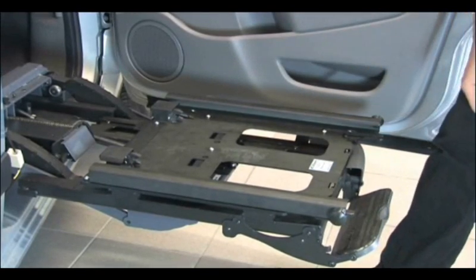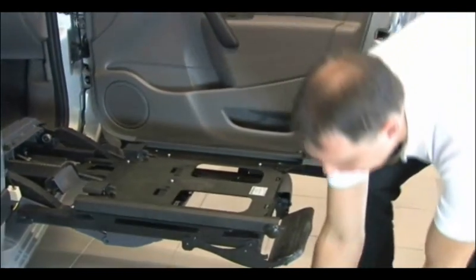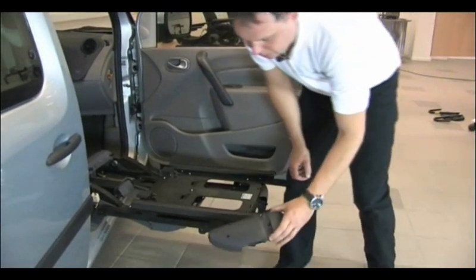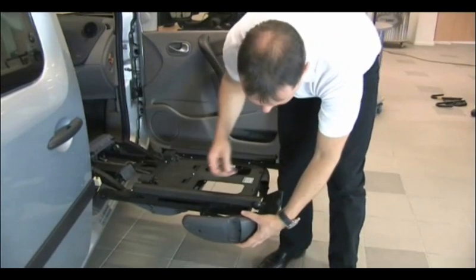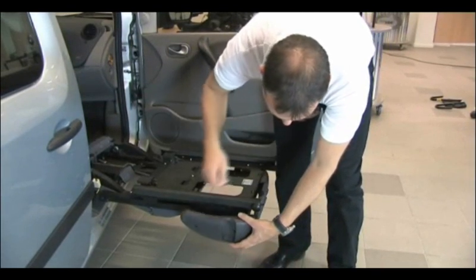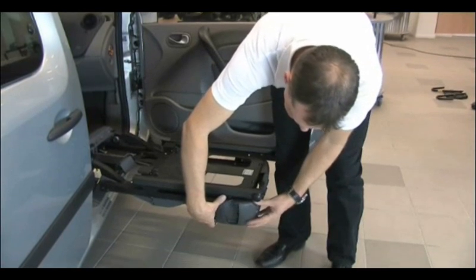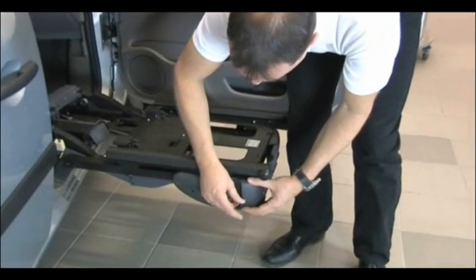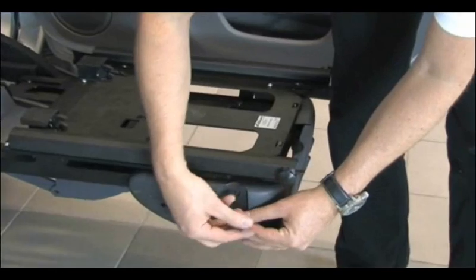And now it's ready to use. But before you use it, you of course put the shrouding back again. The easiest thing to do this is to put the 2 bolts into the holes. Lift up the footrest, line it up with the front here, and then try to find the bolt with the Allen key. See if you can find the thread.